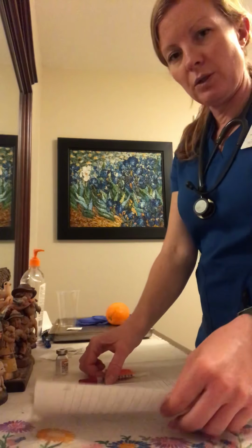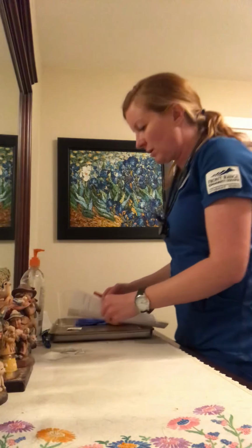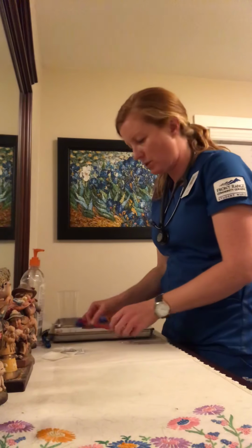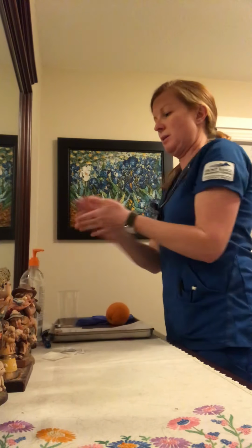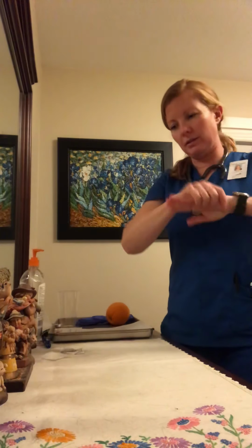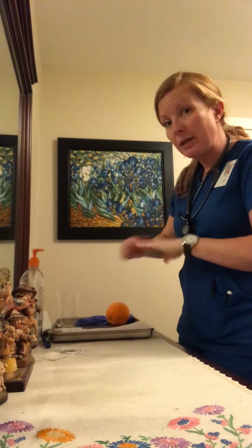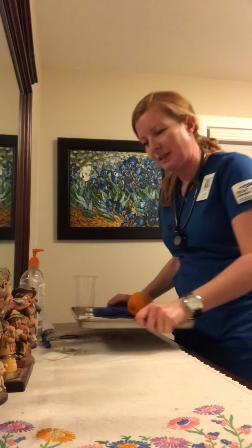So I'm going to take my drug vial, I have my MAR, and I have my syringe right here on the bedside table. I'm going to set it on the bedside table. I'm going to wash my hands. And I'm going to move the bedside table a little closer to the camera before I introduce myself.